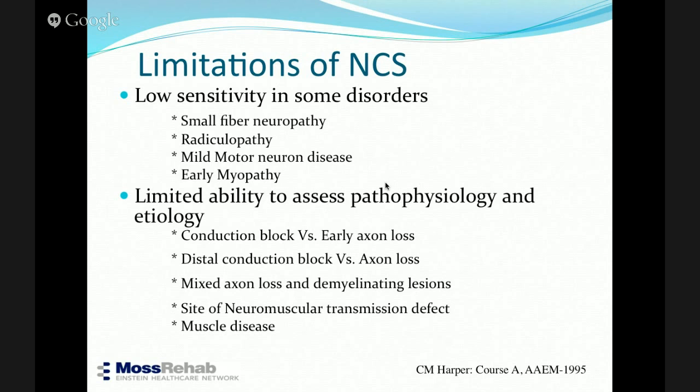However, if you change the technical aspects of it, you might be able to get information, because in myasthenic syndrome, you're going to have a huge increase in amplitude if you stimulate faster, or if you give a short amount of exercise, the amplitude changes. I'll show you a recording of that. And in myasthenia gravis, there's going to be a decremental response. So there's going to be a little bit of a difference in that.